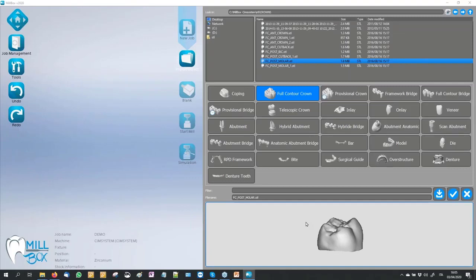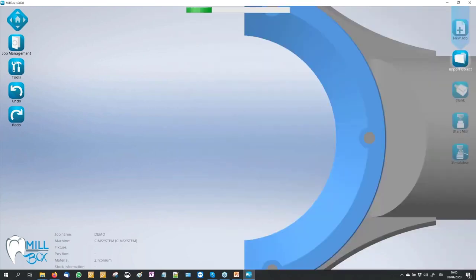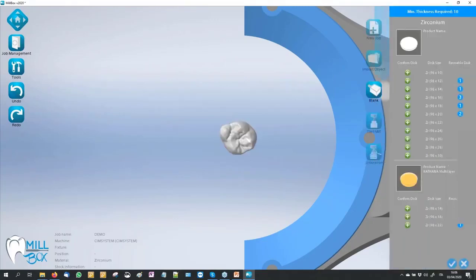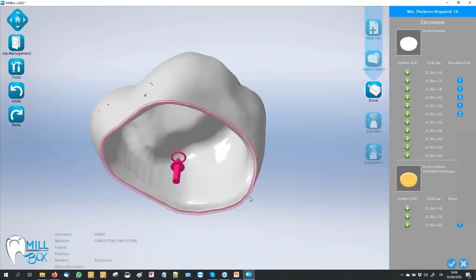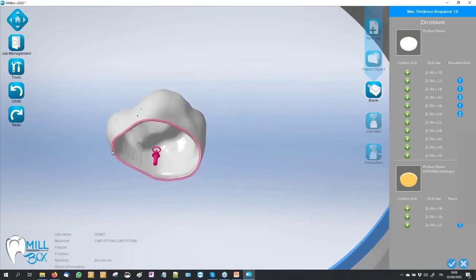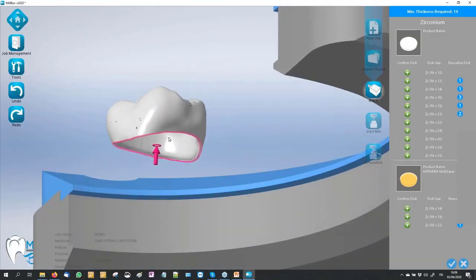This is very important to have the best result and a good way to mill our job. After we select, we can confirm our STL. The software is analyzing all the features on our object. Millbox is able to work with or without the construction info from different CAD software and creates its point of reference. Millbox recognizes automatically all the margin line and also, in this case because it's a simple object, the insertion axis of the cavity crown.